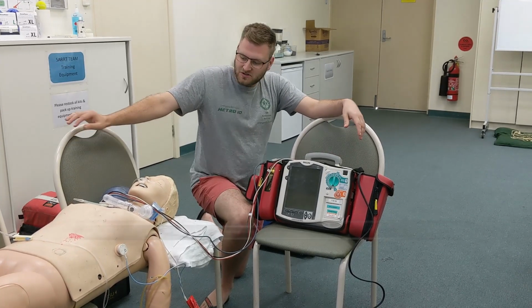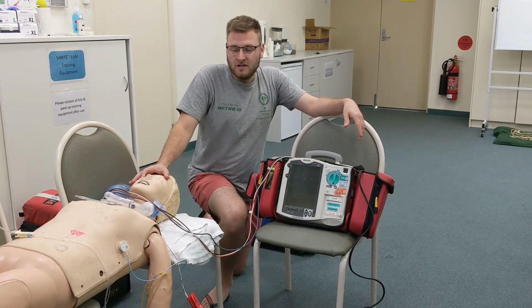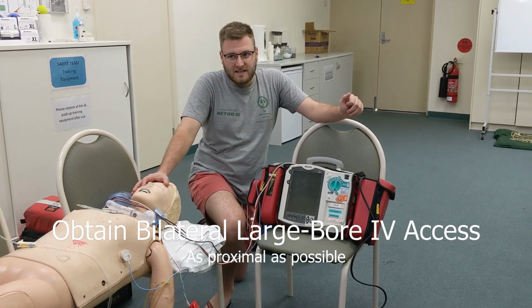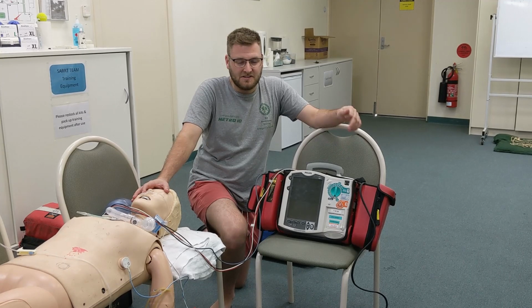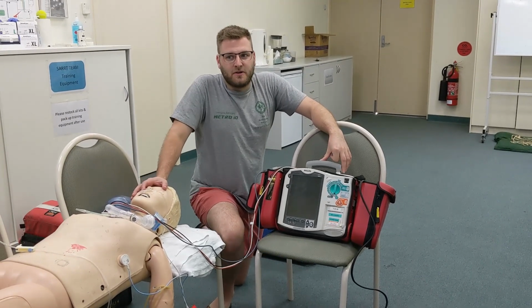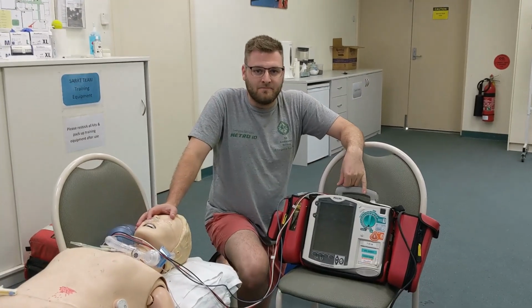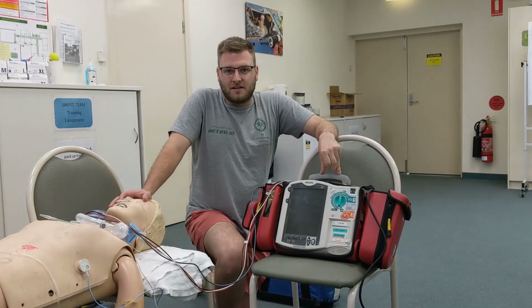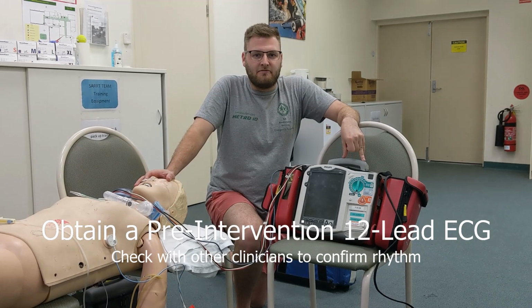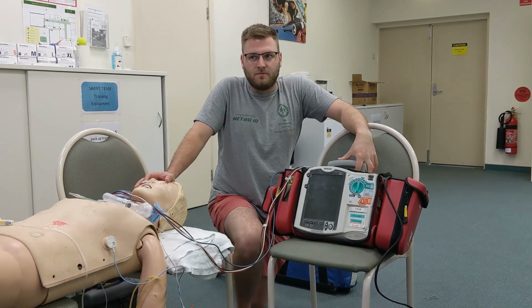Provide some supplemental oxygen like we've got here, also with some end-tidal CO2, and also again preferably bilateral large bore intravenous access, and get some fluids running with that. Obviously, you need to keep an eye on the patient's vital signs, blood pressure, ECG, SATs, end-tidal CO2, and respiratory rate. Prior to commencing the cardioversion, we want to obtain a 12-lead ECG and have that interpreted thoroughly, and maybe even have it checked by another clinician as well.